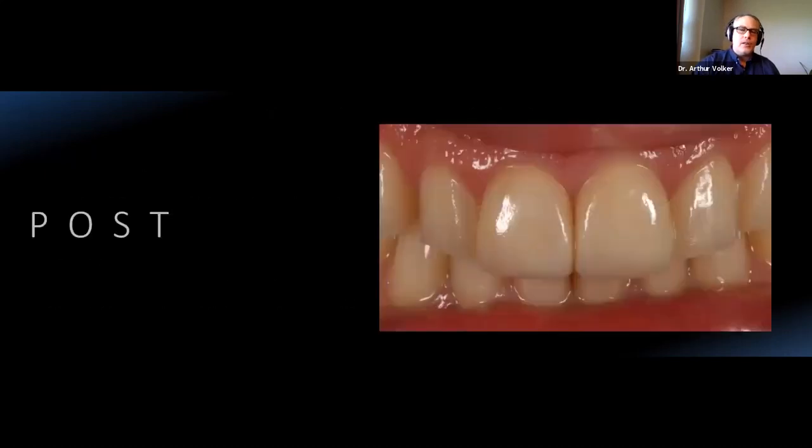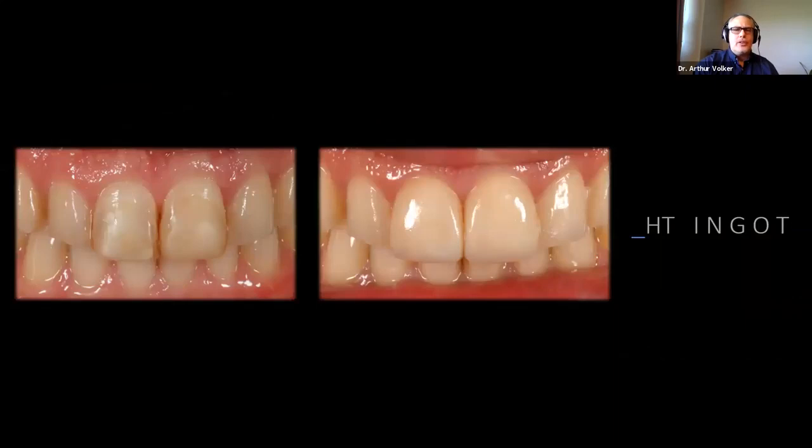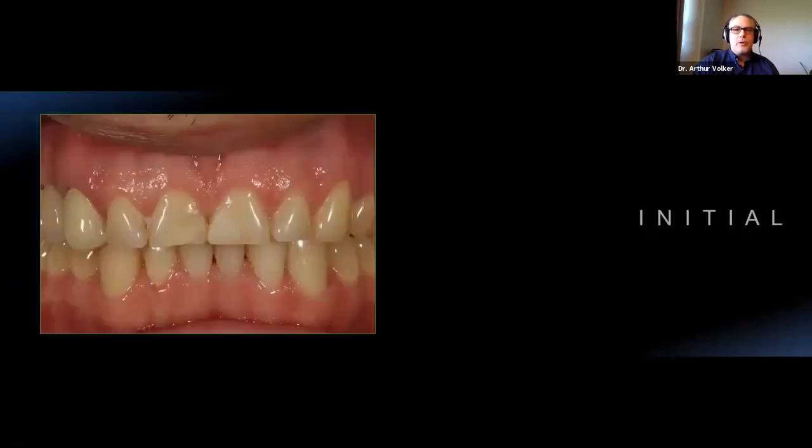And so this is what it looked like about a week later after delivery, and you can see, or maybe less, you can see we had a very nice aesthetic outcome using a very high translucent material to help take what's underneath and provide, like I said, a very, very minimally prepared and in my opinion, quite nice job by the laboratory. Okay, so let's take this second case. And so that was something using a high translucent where we want to mimic what's underneath.